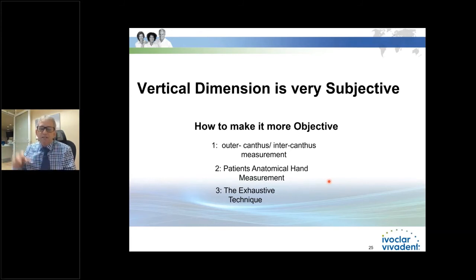Not really. But you just want them to keep going, M, M, M, blowing out at the same time. Then they're going to take a deep breath and do it again, M, M, M. Take another breath, M, M, M, blow out. And then on the fourth try, you're going to want them to stop somewhere in the middle.